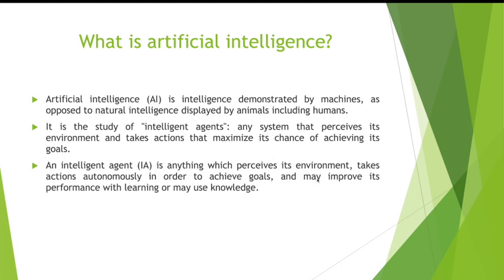And then there's another important aspect that you need to be aware of, and it is the fact that artificial intelligence softwares learn from their own mistakes. Let's say that it comes up with the wrong answer, then this mistake is fed back to the software and it learns from its own mistakes. Basically, artificial intelligence softwares have something known as a cost function. Now, the cost function is a mathematical function that keeps track of all of the mistakes that it has made, and every time it makes a mistake, it is penalized.